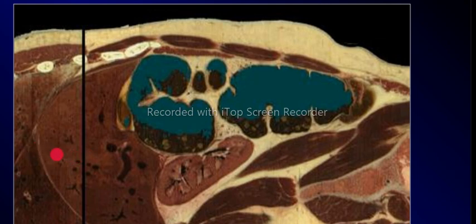Now the first scan we are cutting through is this one where you see the black line. So it means we are picking abdominal organs, right? Like the liver, but we're also picking this point of the diaphragm and this point of the lung tissue here. So if there was fluid collection within the thoracic cavity, we'll be able to pick it in this recess because it is the deepest part. So on an abdominal scan, you can be able to see pleural effusion.